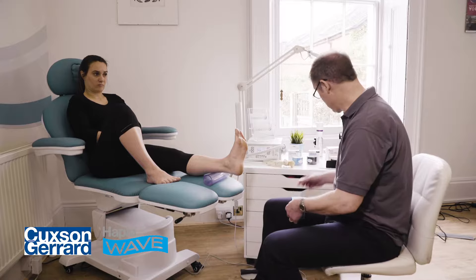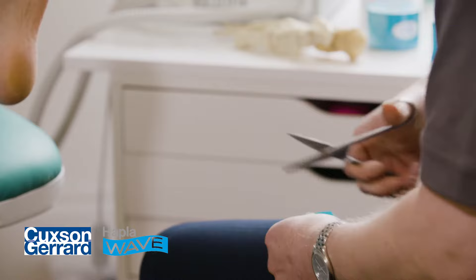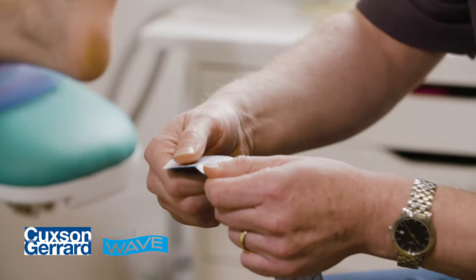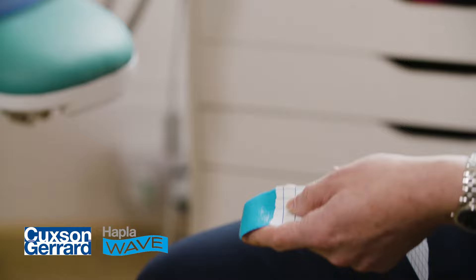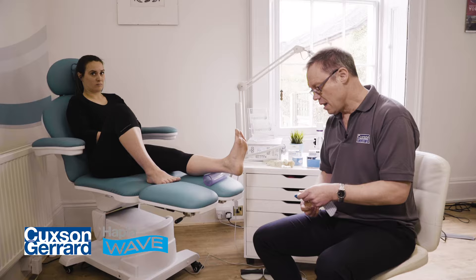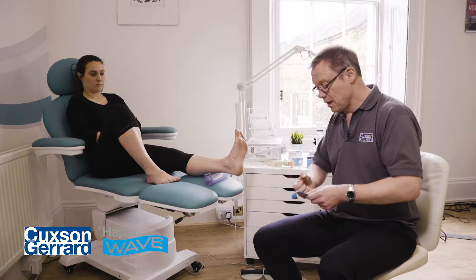Let's cut that off now. Let's round those corners so that hosiery doesn't have a chance to grab it and wrench it free. First, we're going to establish an anchor point, and we're going to do that by tearing the paper and then just pulling the tape — because it's very elastic, the paper breaks. Let's peel off this paper backing to reveal the first anchor point, which reveals the arrangement of the elastic tape underneath. It's in a wave pattern for stretch, hence the name Haplowave. There's a golden rule when applying this elastic tape: no stretch on the anchor point. We're going to establish the anchor point, then stretch the central portion of the tape and establish a further anchor point at the myotendinous junction.